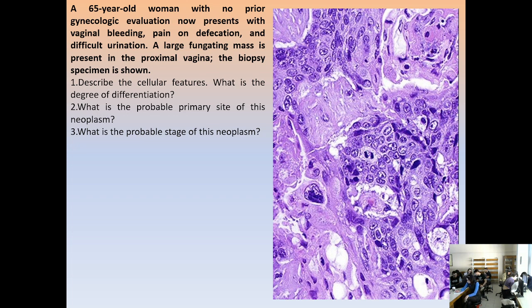And how can this be provided? All right, we have some morphologic signs of squamous differentiation. How can we verify that this is squamous epithelium? Is there a method we use in pathology to define where these cells come from, where they derive? Which is this method? It's not a routine stain, such as hematoxylin eosin. It's a specific stain. Yes?